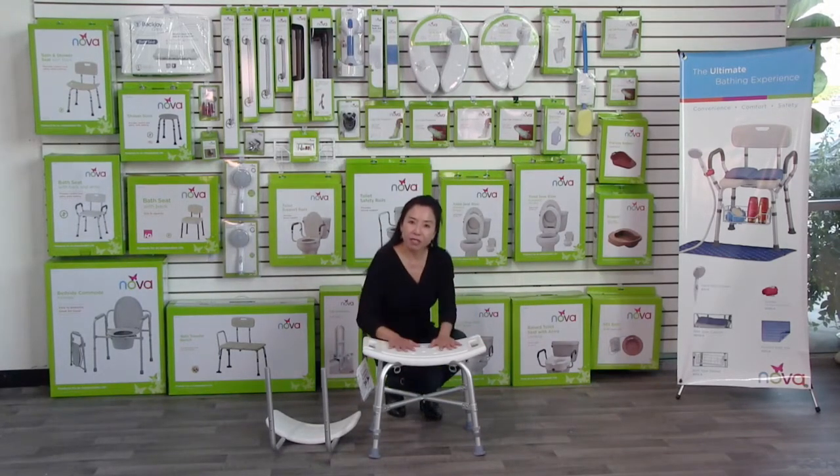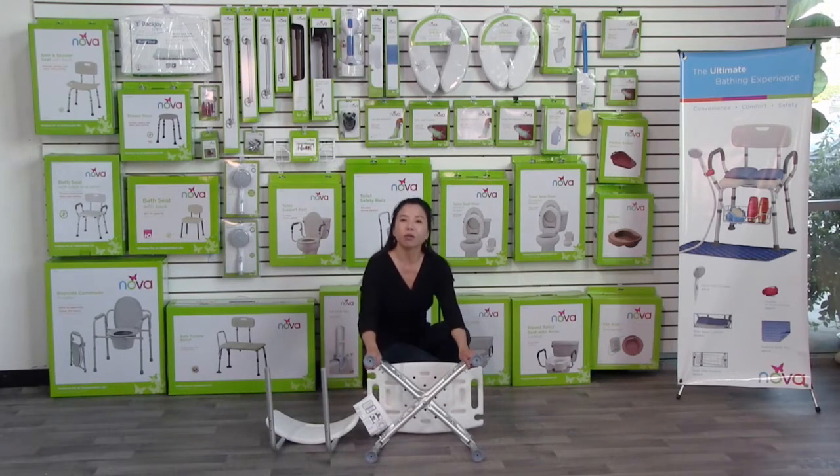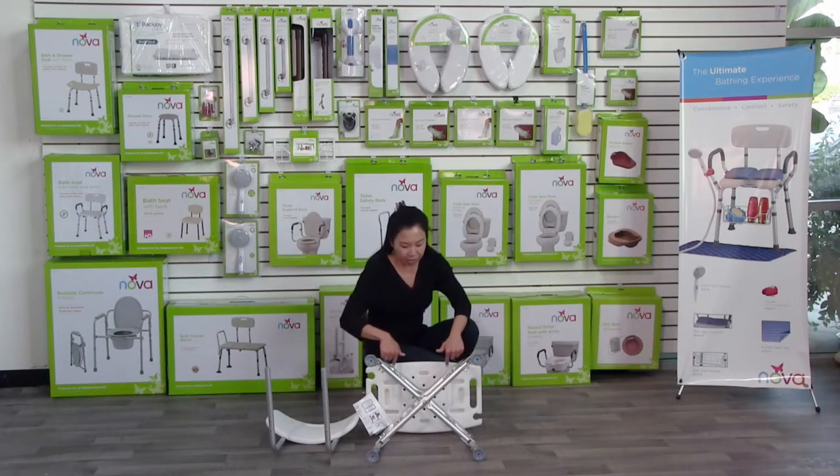First, I'm going to show you the bath seat. When you receive your bath bench, it's going to come assembled just like this. All you need to do is insert the backrest. I'll turn this over and you'll see that there are four legs that are fully adjustable so you can adjust it to your desired height. We've got the crossbar that reinforces the frame, and then you have these inserts here — that's where the tubes for the backrest are going to go.